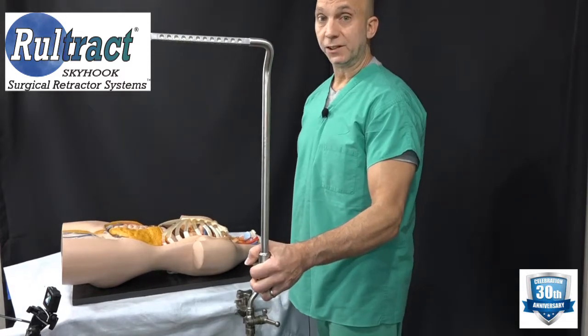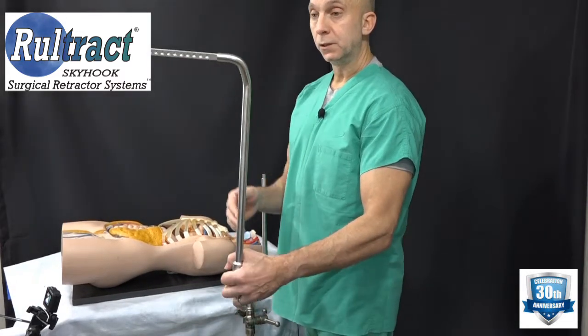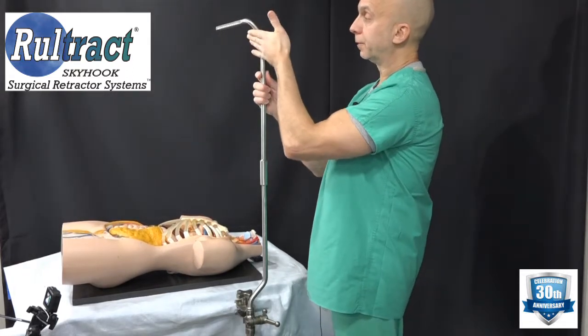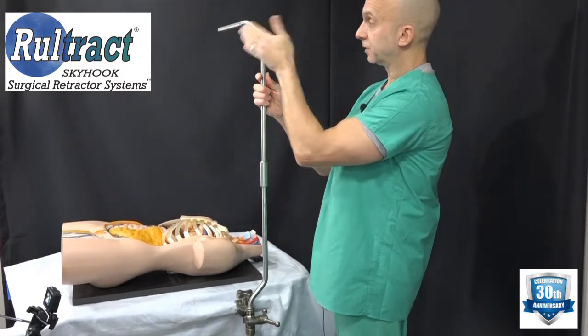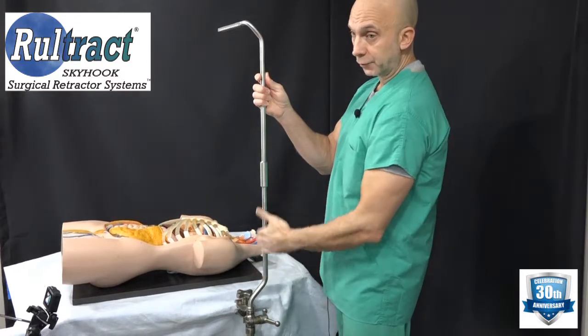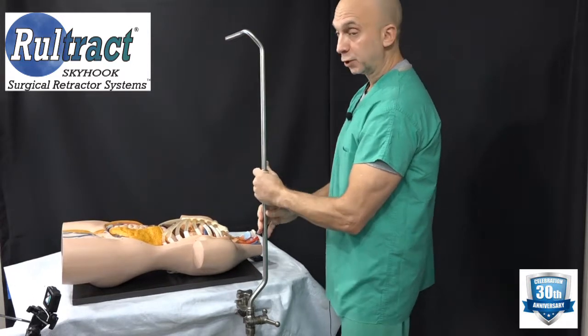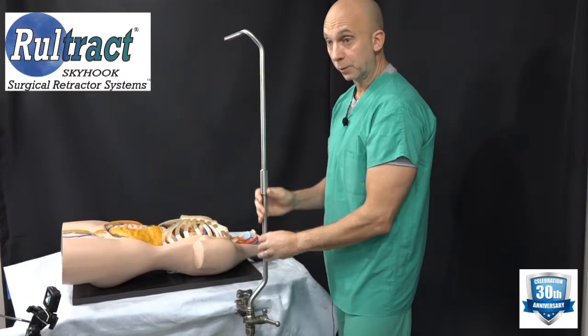Next, take the top post. Again, I like to have this part of the bend going toward the patient's head — this allows for more space for the assistant or the surgeon. Go ahead and set that on; you may have to turn it to make sure it seats properly.